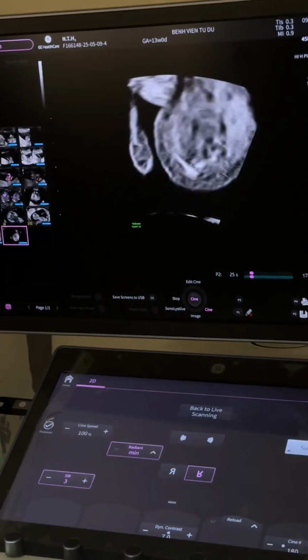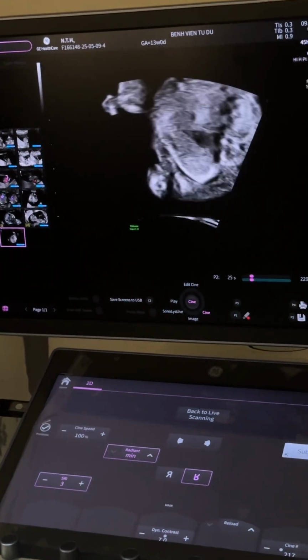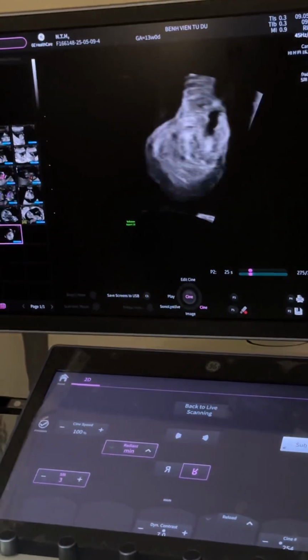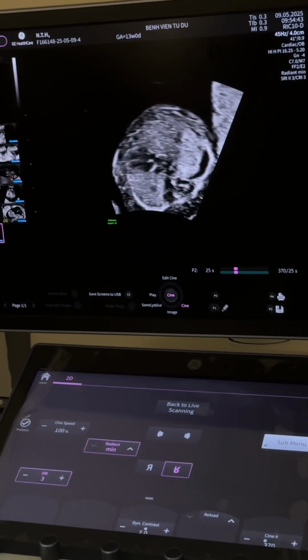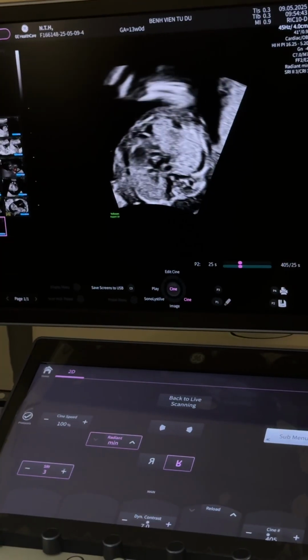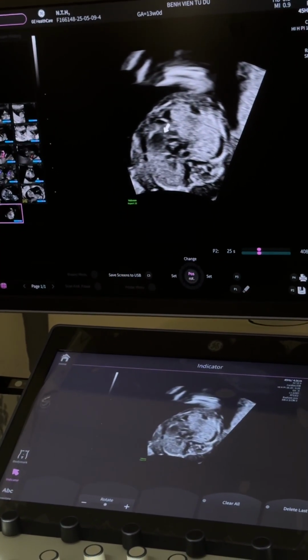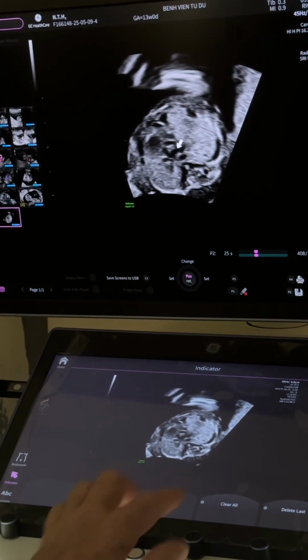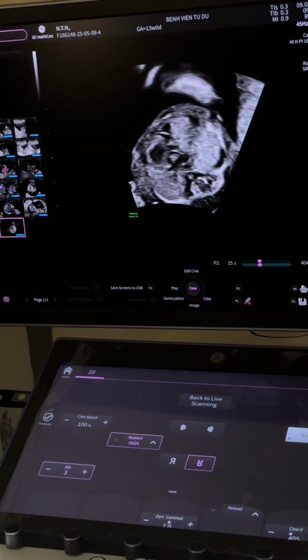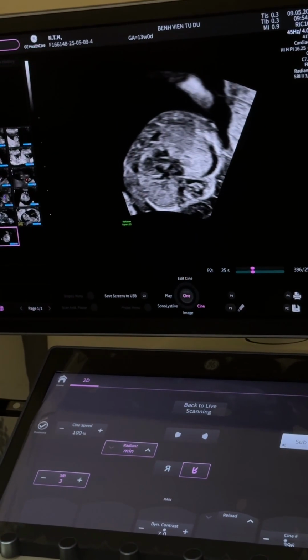You also appreciate when you look at this baby, it's got a pericardial effusion. So that's also another marker. When you see a pericardial effusion in any baby, most of them are benign, but if they extend up to the level of the AV valve, then they're going to be significant. Here is the right atrium coming in, this is the right ventricle, and this is the junction of the AV valve. When you look at that pericardial fluid, you see it extends beyond the level of the atrioventricular junction.